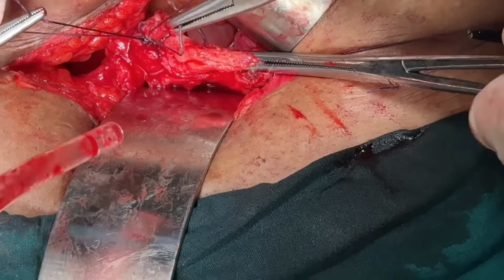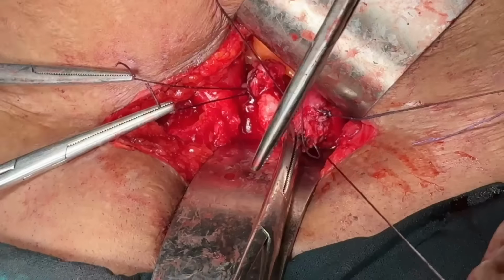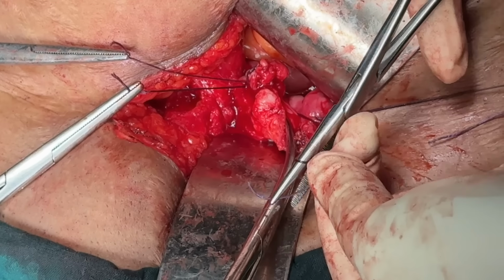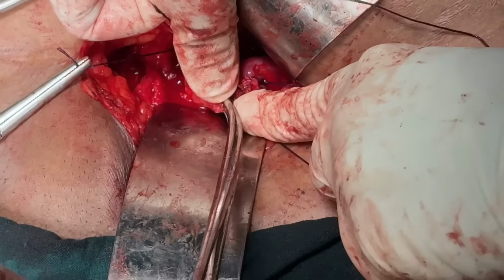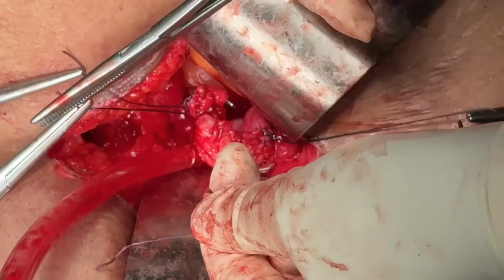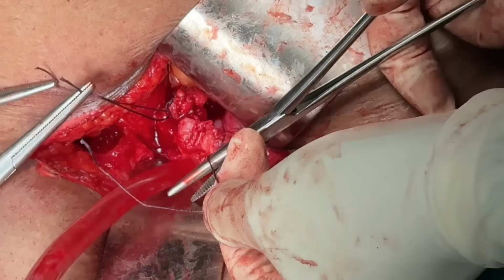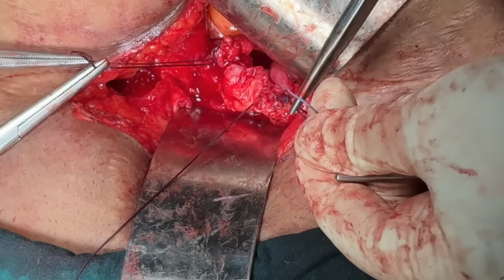Similarly, we go on to the other side, see how the peritoneum also is included posteriorly. Sometimes this peritoneum causes oozing of vault or bleeding here. So better to include it in your suture. The exact procedure is being repeated here on the left side too. So first we secure the vaginal angle and then keep one end of the suture long, which will be tied to the uterosacral ligament of the same side to reduce the risk of wall prolapse later on.